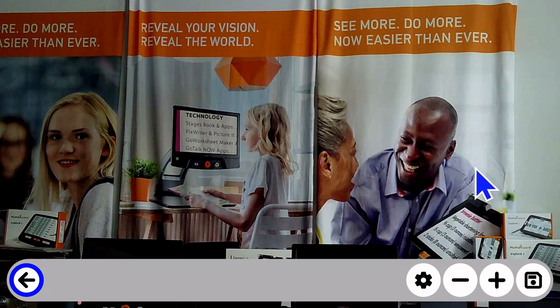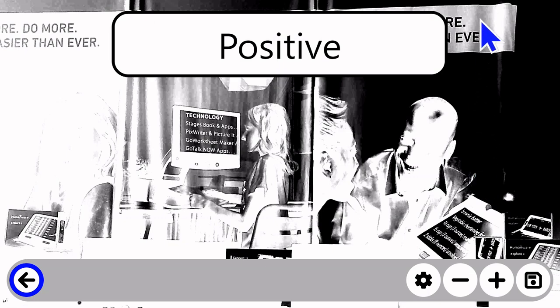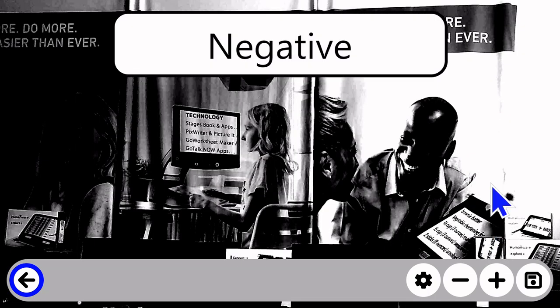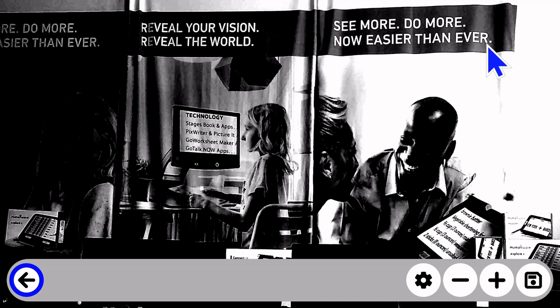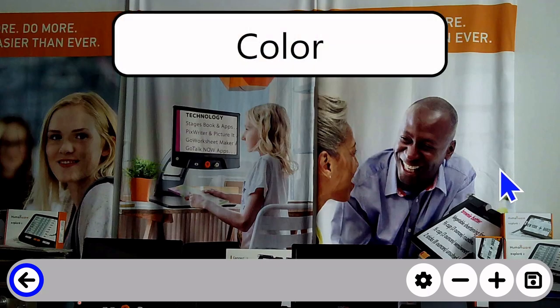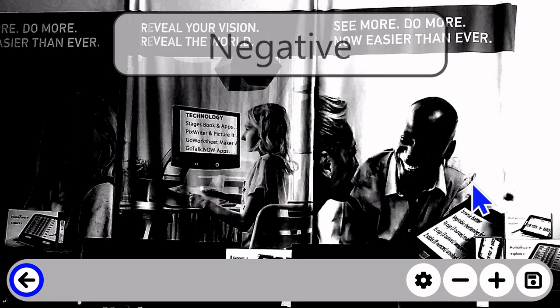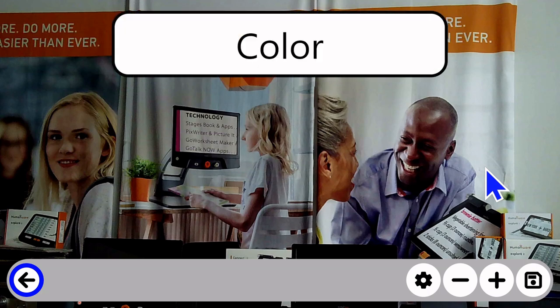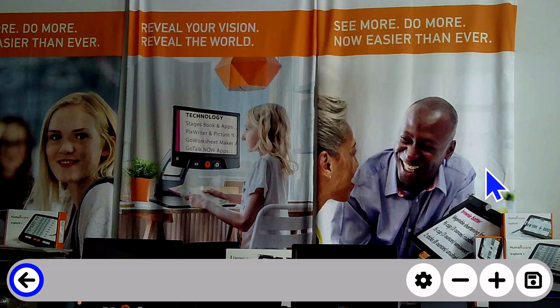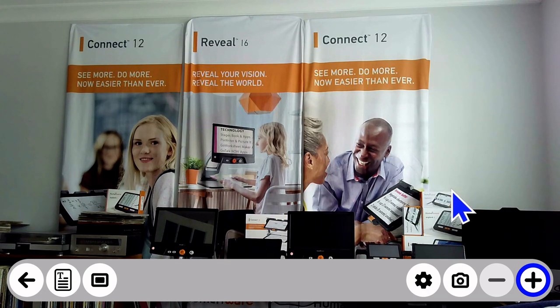Right now we're seeing it in full color, but I can drag down on the right hand side of my screen with a click and drag or a quick swipe on a touchscreen, and I can cycle through different contrast colors on that image that I'm seeing. So I'm just doing it again here, and again, that's a click and drag or a touchscreen with a quick downward gesture with a finger on the right hand side of the screen. And this will work the same both on captured images or in live views.